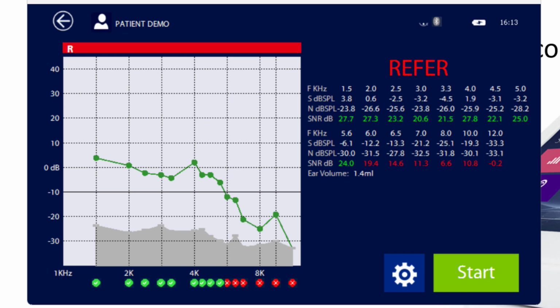The reason why is that there is a requirement that otoacoustic emissions are at least above -10 dB SPL. That's a safety measure. With any equipment on the market, there is a chance that if you accept OAEs that are at too low a level, you actually measure an artifact that could be produced by the equipment. It depends a little bit on how the probe is positioned and other things, but having this -10 as a safety barrier is a very common thing to do. And it also applies to our instrument.